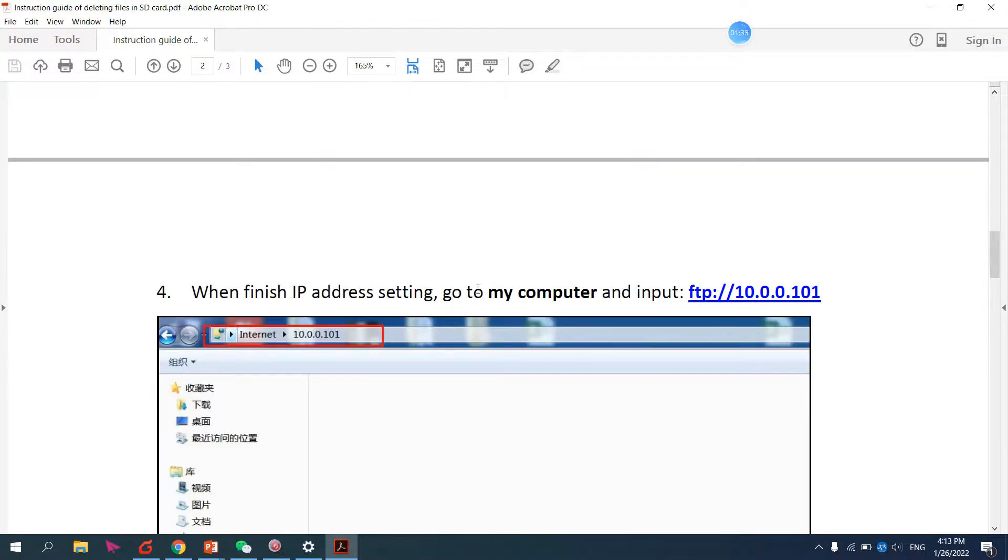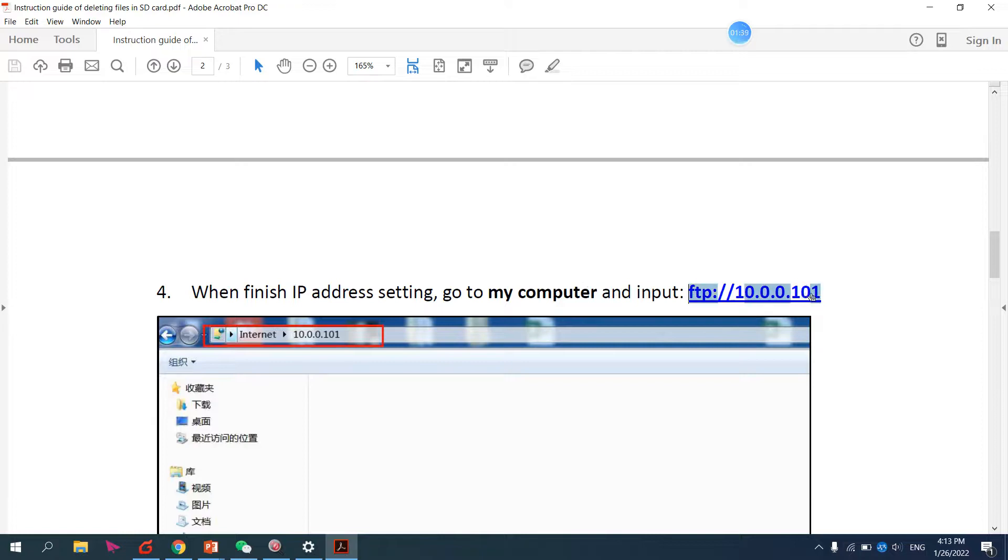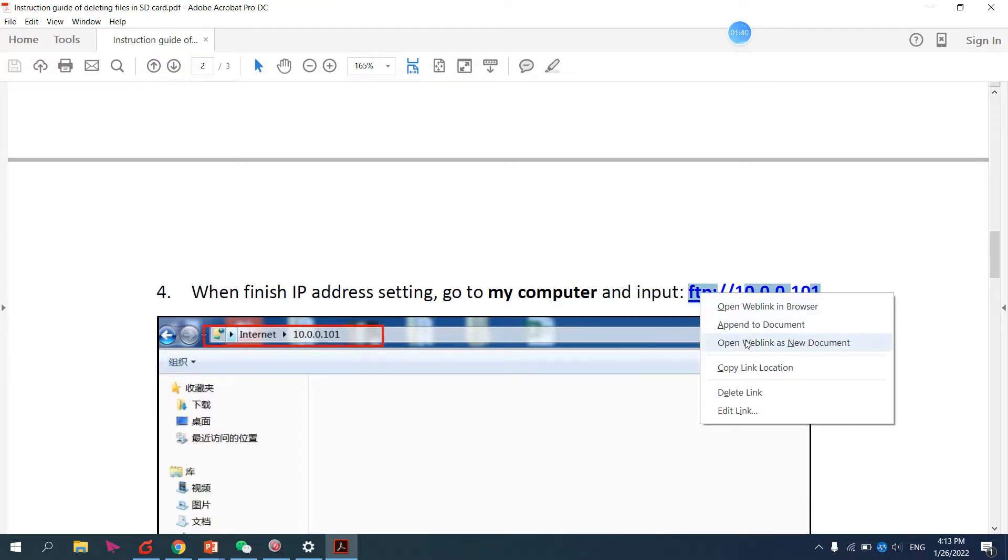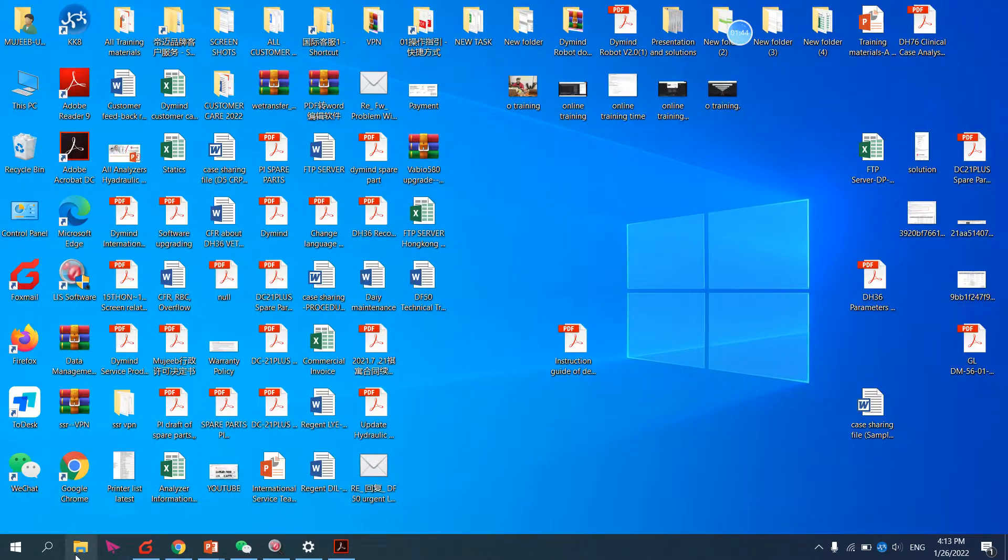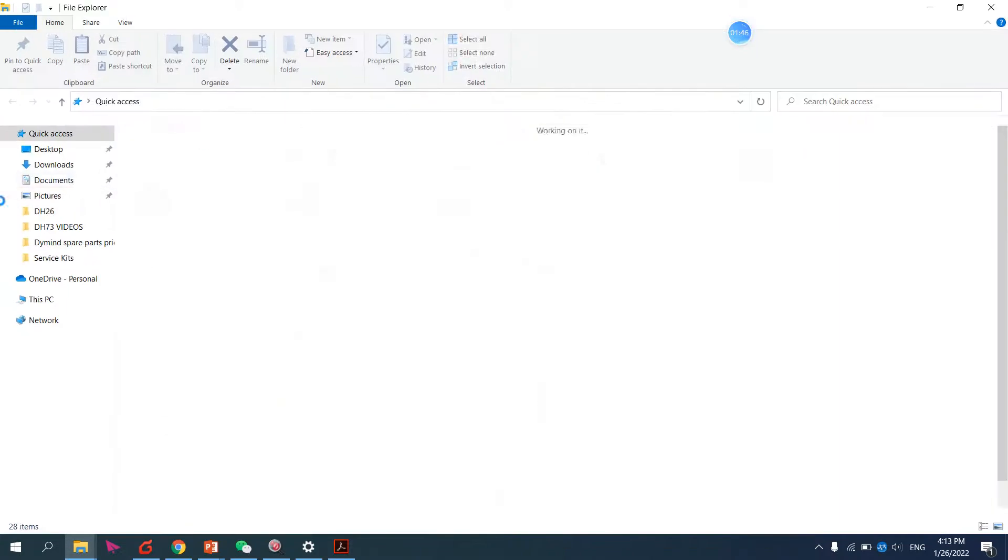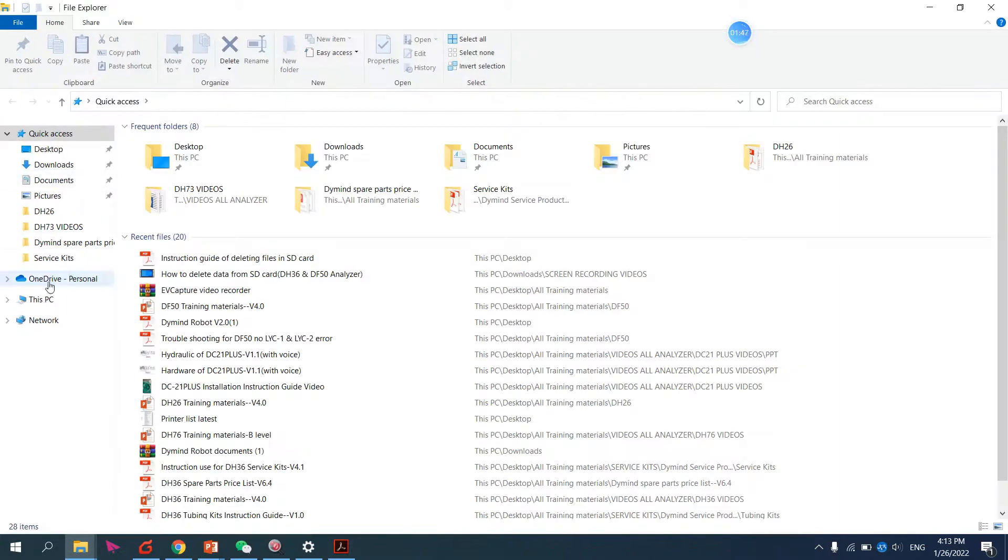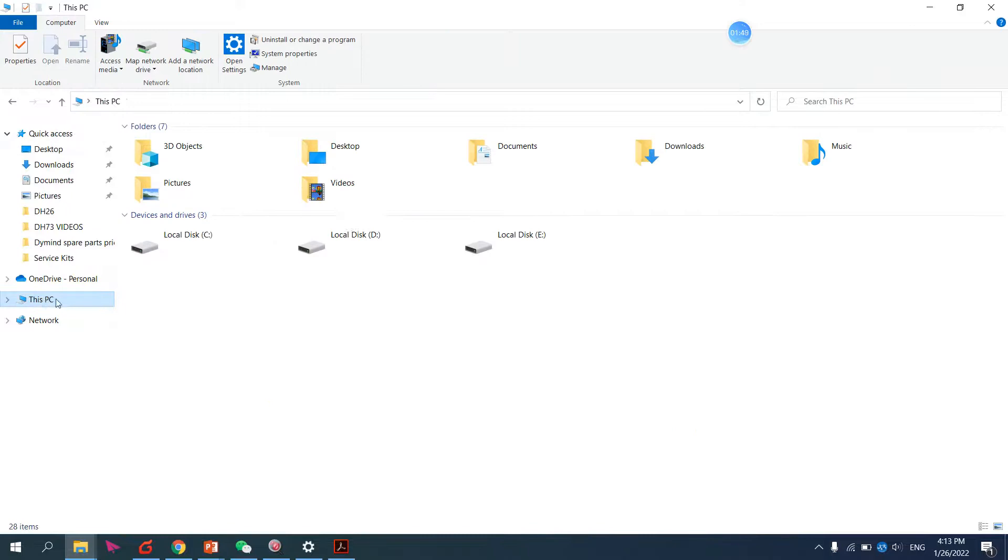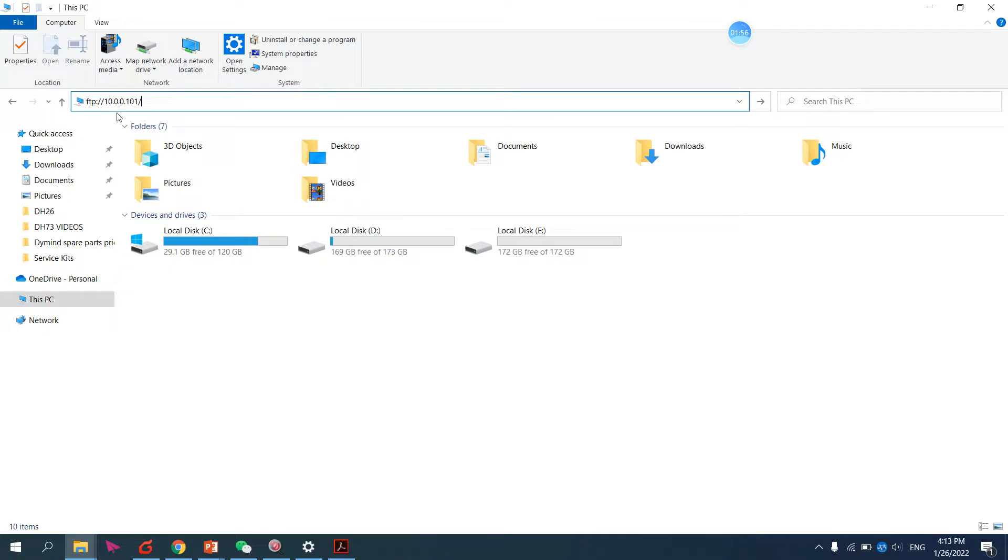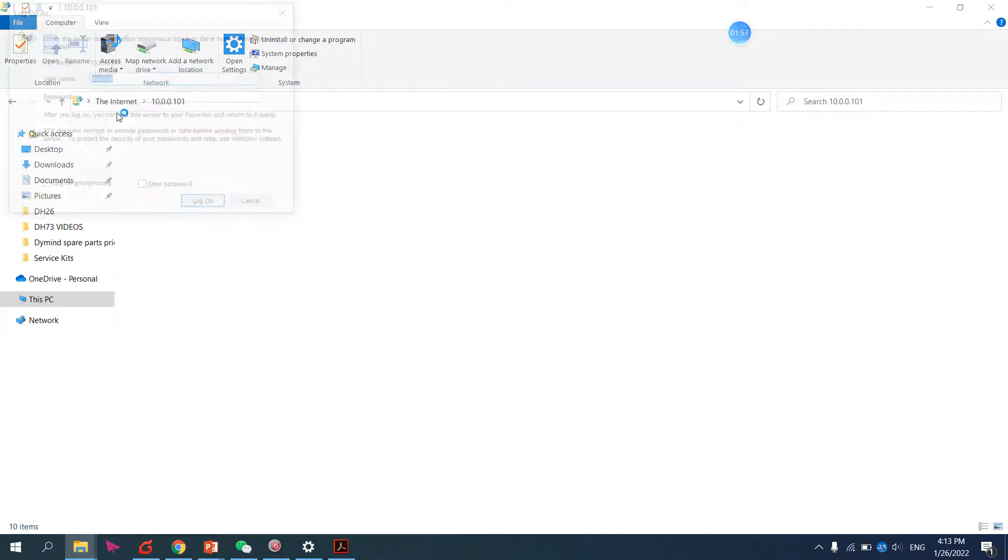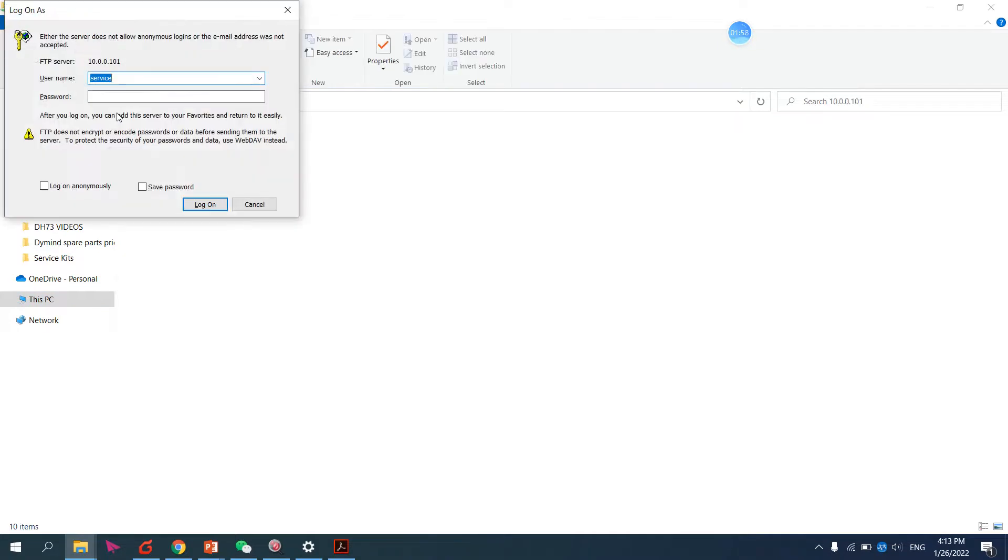Just copy this IP address and go to This PC (My Computer). Then paste the IP address here and press Enter.